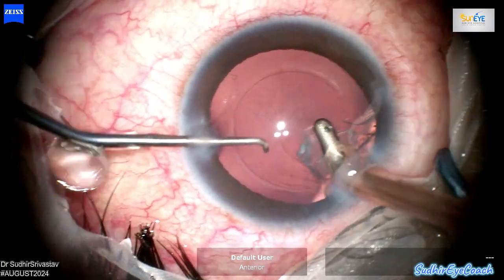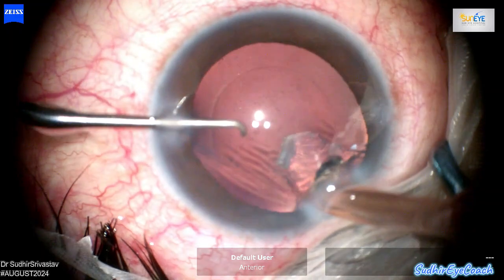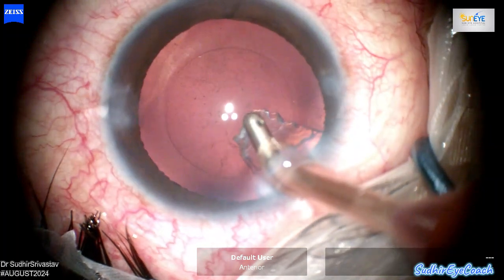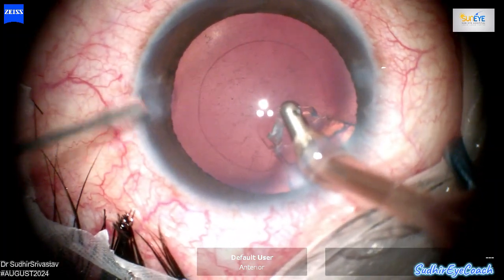Now we can see a small posterior capsular tear approximately 1 to 1.5 mm in diameter, and fortunately it is circular. Although some fluid has leaked behind the posterior capsule into the vitreous cavity, as evidenced by fine particles now visible in the vitreous.